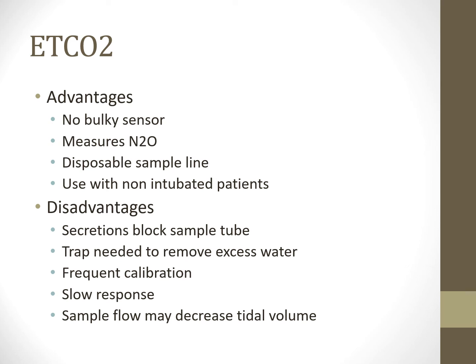We have the end-tidal nasal cannulas. I believe even the oxymasks have end-tidal capabilities as well out there. Disadvantages, secretions can block that little sample line. You can get water in there. You need to remove excess water from that trap that purges gas from the line, because remember there's heated humidity going on here. You have to calibrate them. Slow response time, we talked about that because it measures it back at the machine versus at the patient.